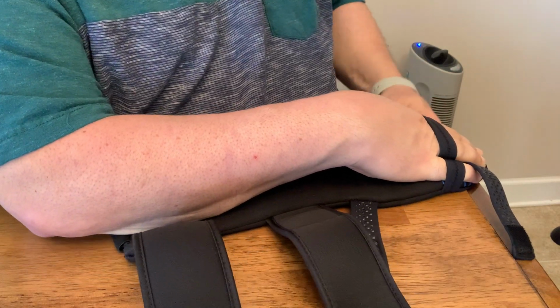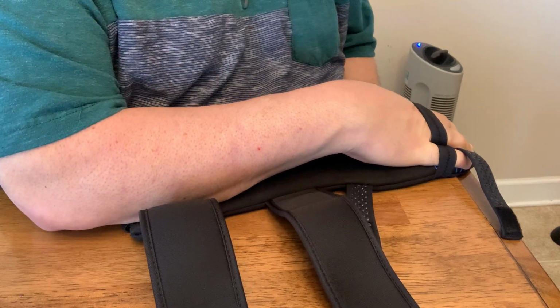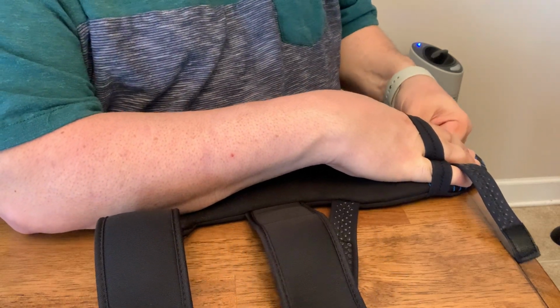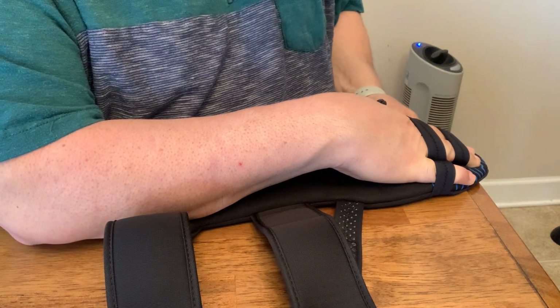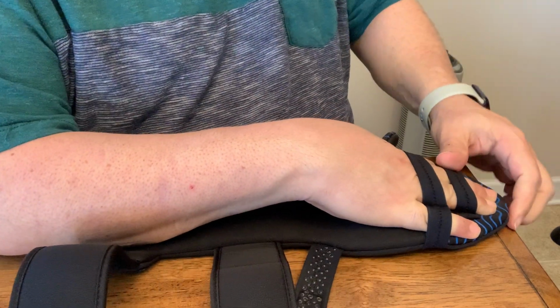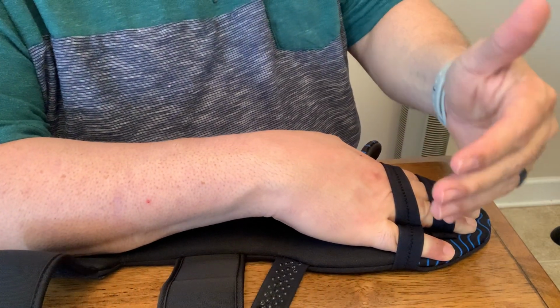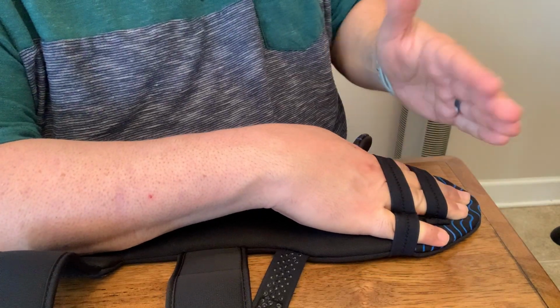Now, to Velcro this underneath, you kind of slide to the edge of the table and tuck it under. There we go. So like half your glove is on, half your glove isn't. And then go over the next set of knuckles, slide it over and tuck under. So that's the first part. The first part's your pinky. I got that in. The next part is these two straps to hold my fingers straight.